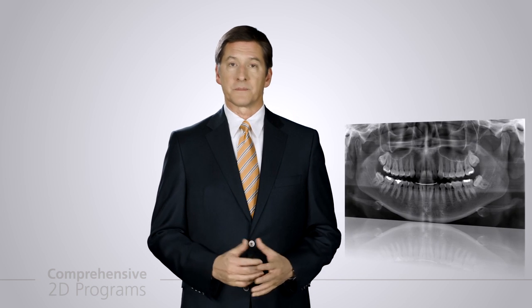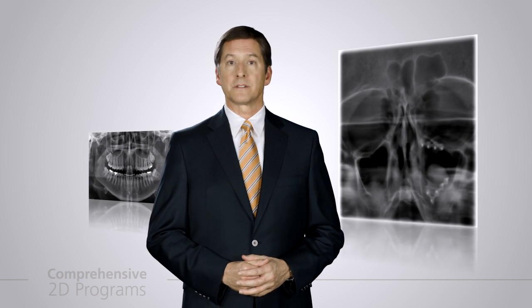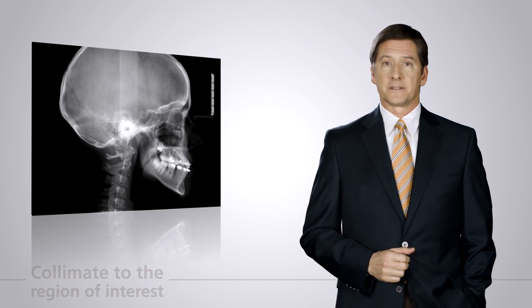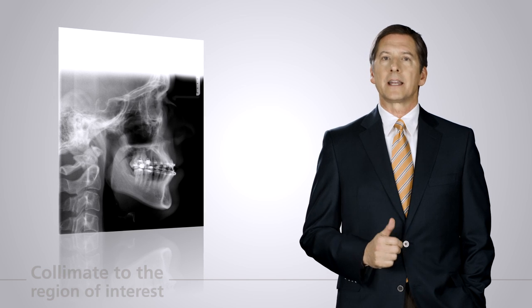The Orthophos XG3D offers a comprehensive list of 2D panoramic programs to meet virtually all 2D diagnostic needs — from standard panoramic programs for adults and children, extra oral bitewing, sinus, to TMJ programs. The right cephalometric program is always at hand with the XG3D ceph unit, from lateral ceph, PA and AP, to carpus programs, with the ability to collimate the width and height of the lateral cephalometric image.